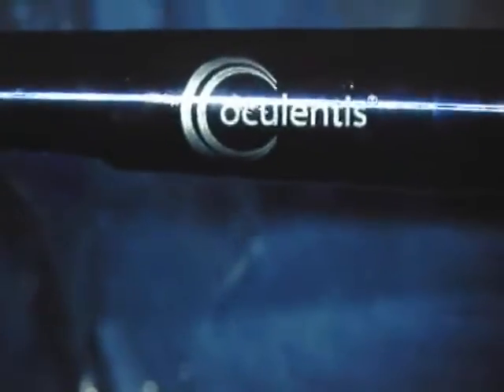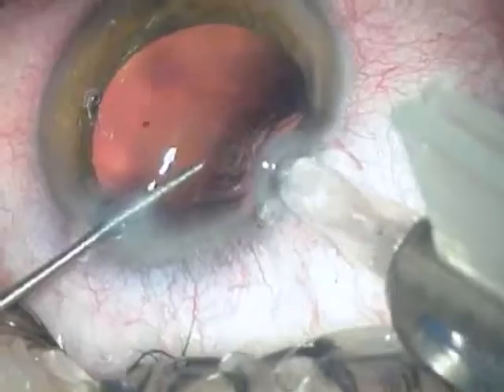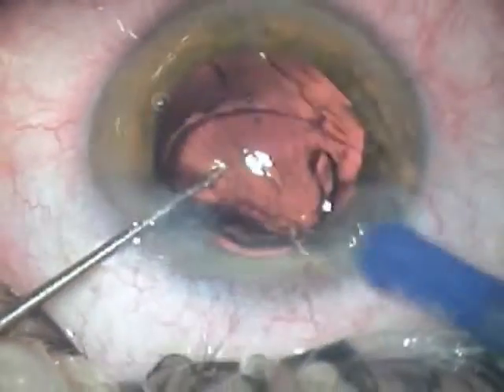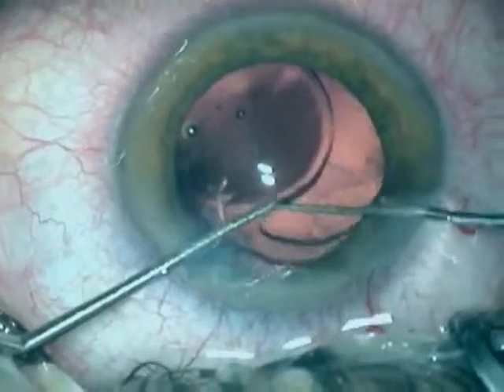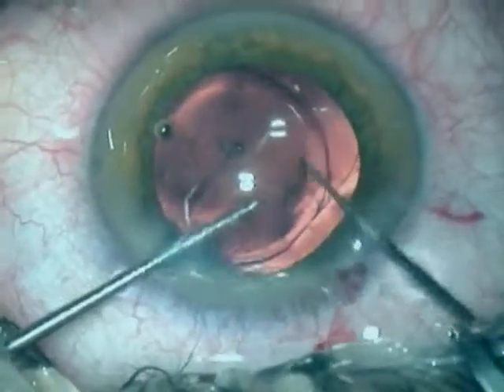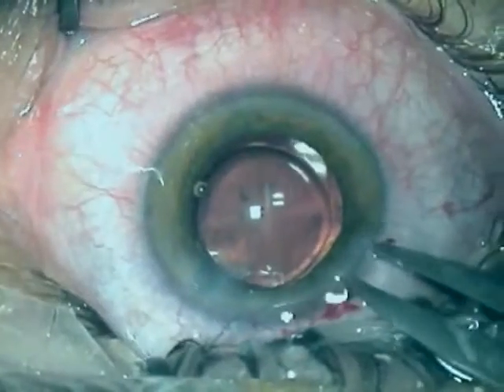We use the Oculentis injector into which we insert the cartridge, and the plunger will push the lens out of the cartridge. Using the corneal-assisted wound technique, the lens is injected inside the capsular bag and the trailing haptic is inserted in a second maneuver. The lens has to be rotated and placed with a notch inferiorly located and two lines defining the sector placed horizontally.